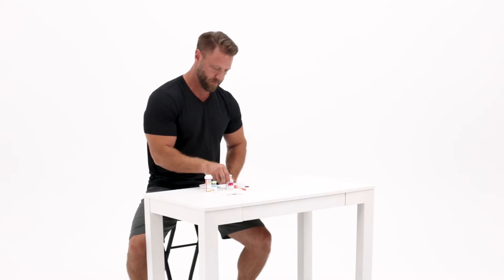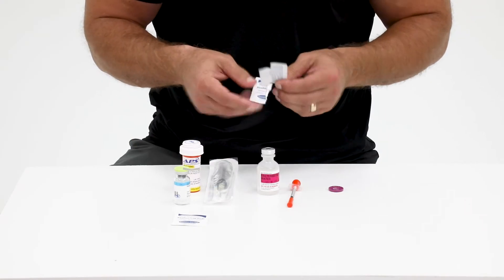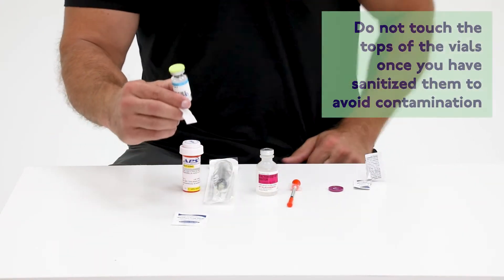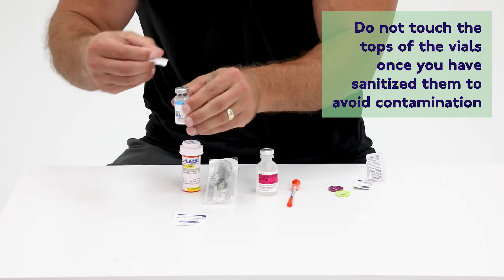Start by flipping the cap off of the vial of bacteriostatic water as well as the lyophilized powder of HCG. Wipe each top of the vials with a new alcohol wipe.